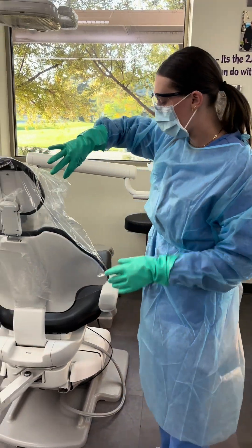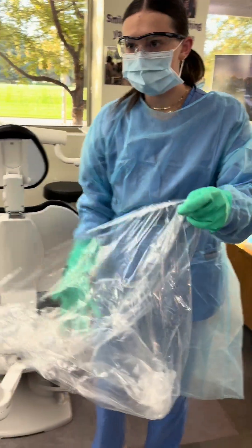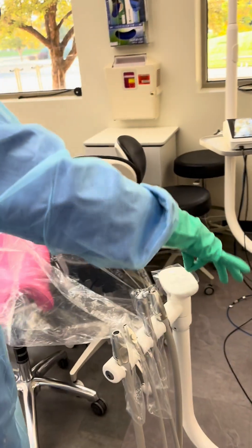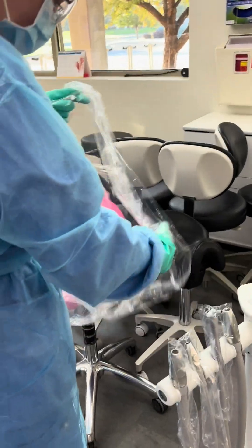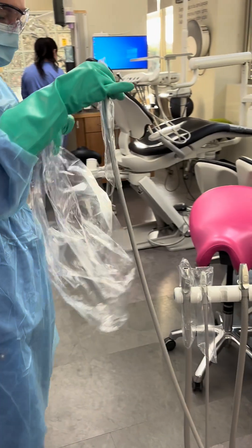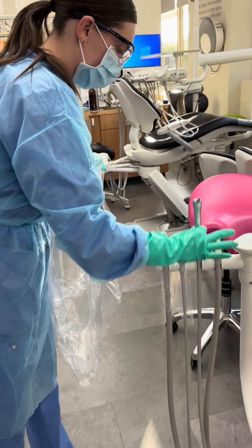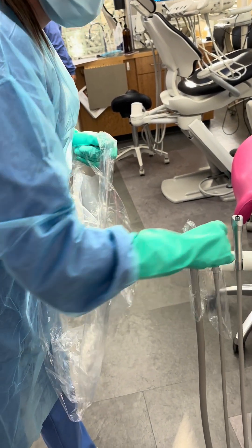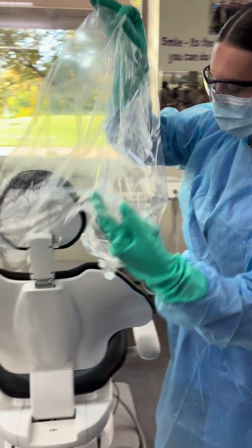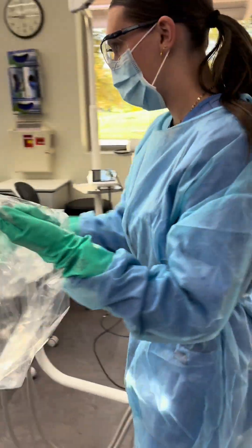And now she's going to take off all the barriers, starting with the chair barrier. Using it as a bag for all the other barriers to put them in.